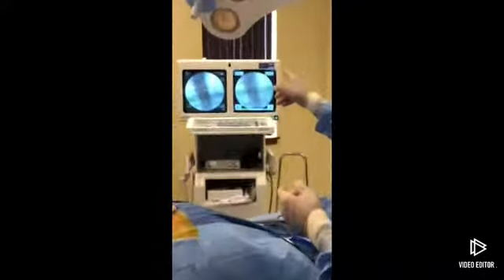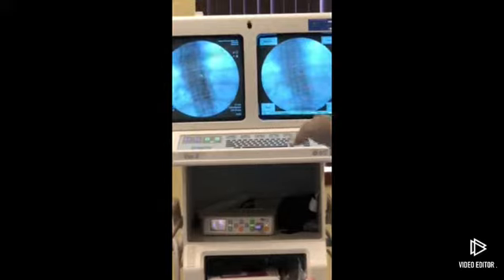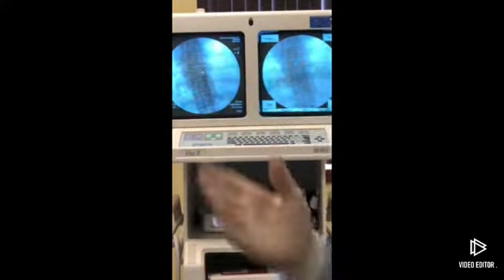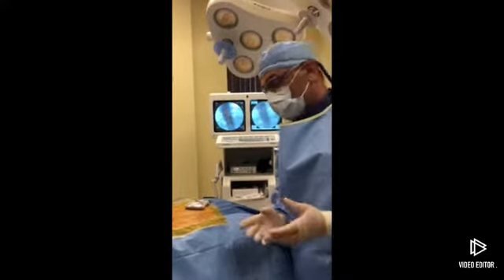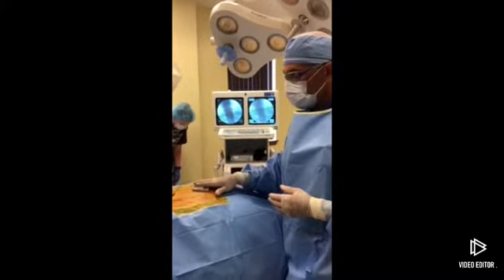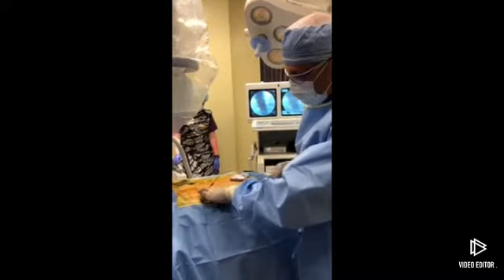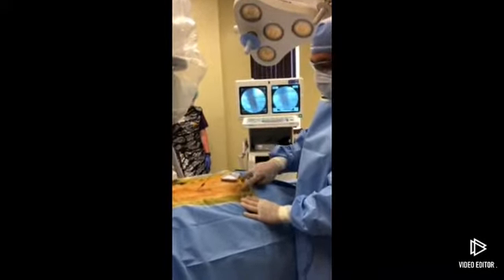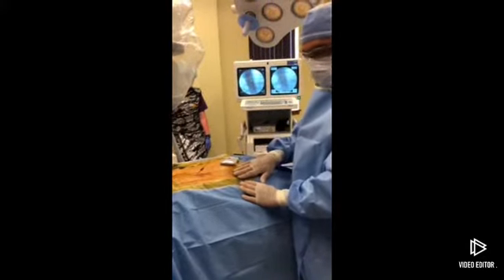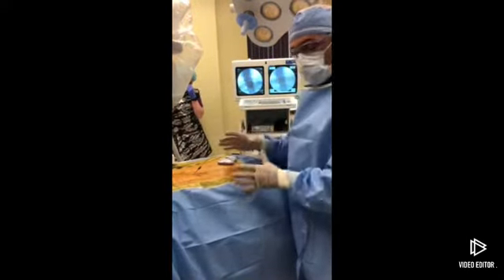If you look at the monitor on the left, you'll see the 8-contact lead traveling from the lower back area up to the T9 area, which is marked there just slightly left of midline. So now at this point, what we're going to do is detach the Bluetooth transmitter, withdraw the needle, and make a small incision right here. I don't know if you can see this on the buttock, but this is where her battery will go. We'll make a small incision here and put a battery under her skin and connect the battery to the lead so that everything will be internalized.